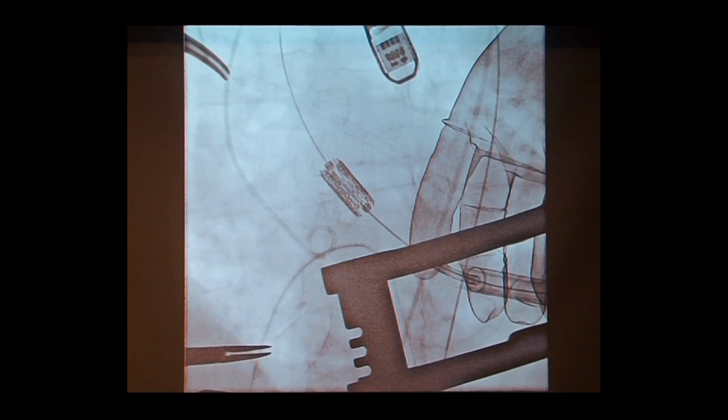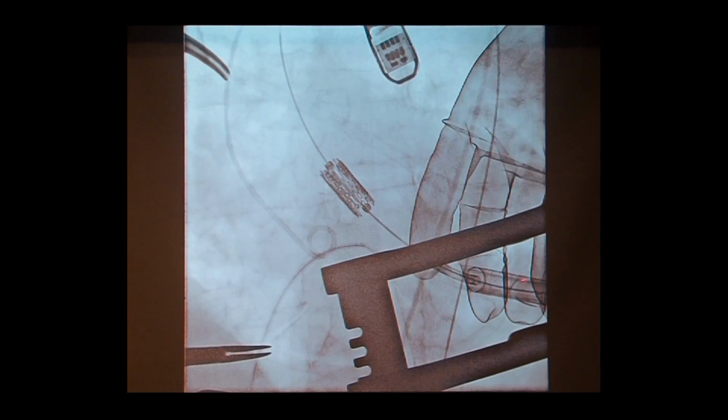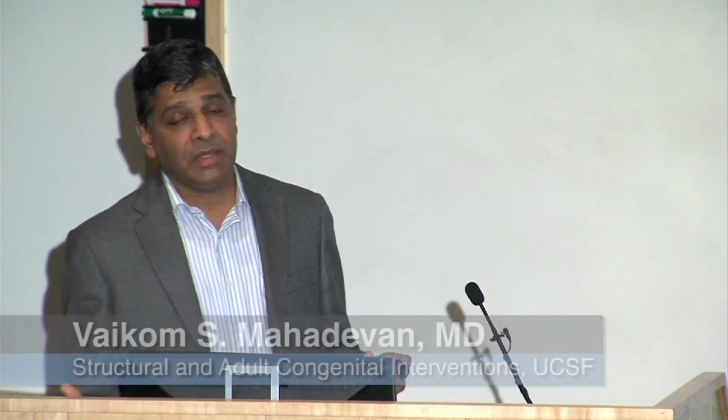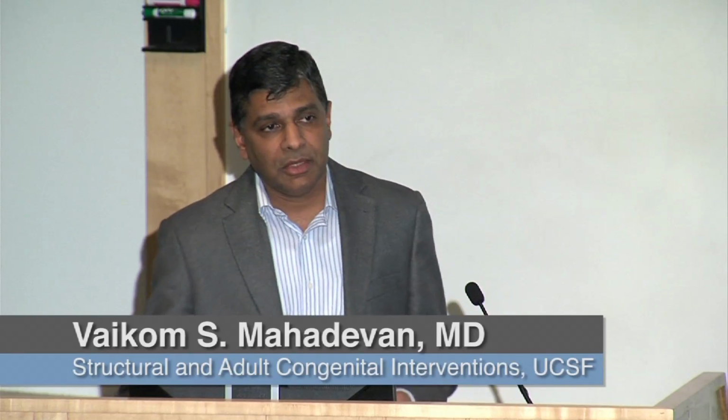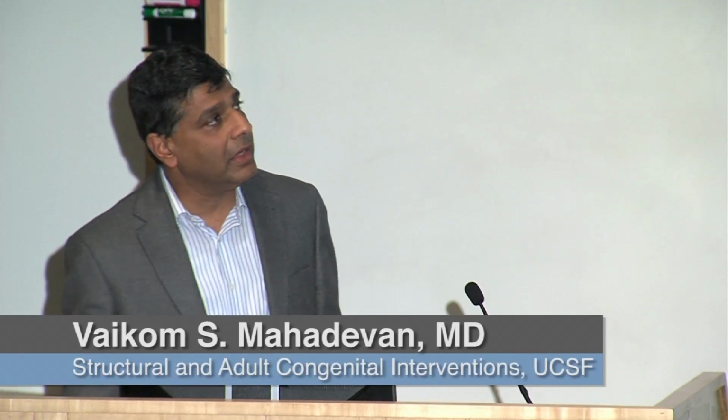And as you can see, the surgeon has made a direct opening in the apex of the heart, and that's the tube in there, and we've taken a valve up through that. So essentially, this is what we call the transapical approach. And then we deploy the valve, and we do an angiogram, and as you can see, the valve is deployed, the procedure is completed, the surgeon closes the hole in the apex, and the patient is woken up in the intensive care a few hours later. The only reason we keep them asleep is because it can be quite painful in the chest wall, so we want to give them enough analgesics to make sure they are free of pain.